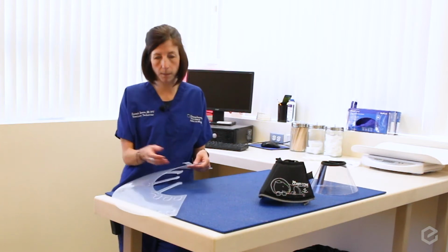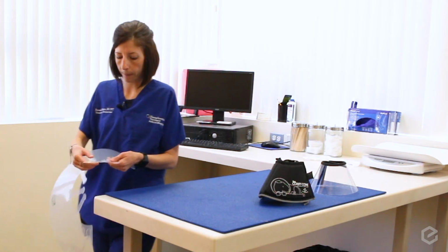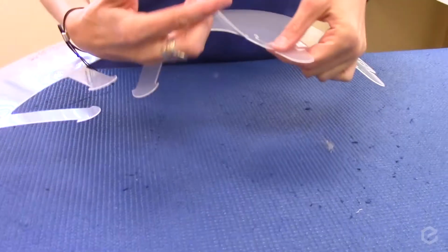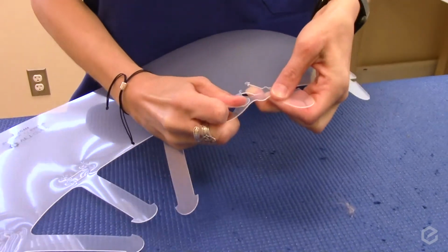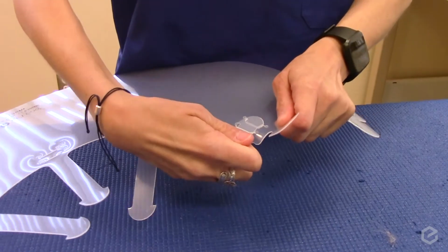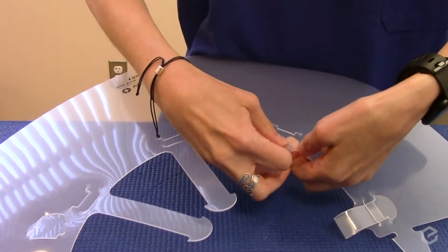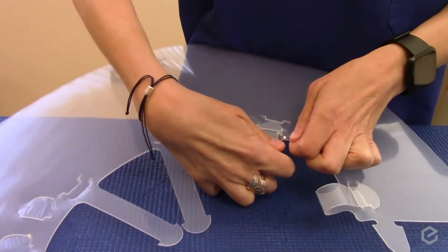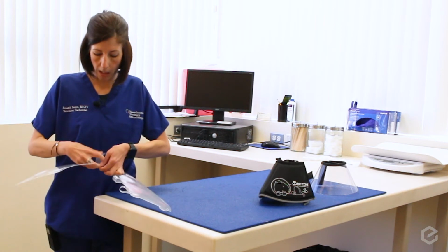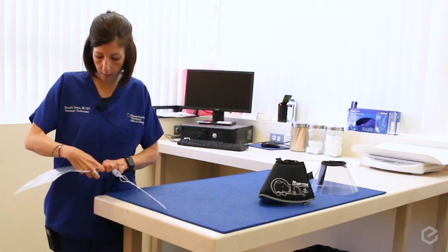And so rule of thumb is you always start going in and come out. So you have your strap here with your little notches for insertion. And so you go in. These can be a little difficult when you first purchase them as they're pretty stiff, but they start to loosen up pretty quickly. So you go in through the top and then you push out and go out through the bottom. And this is going to create your collar to be able to fasten it to your pet.